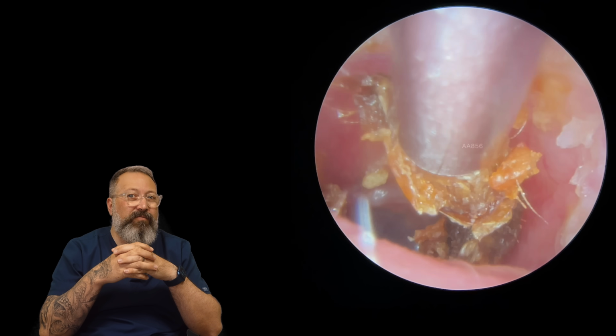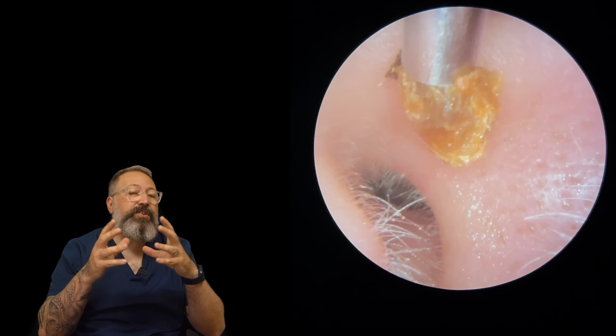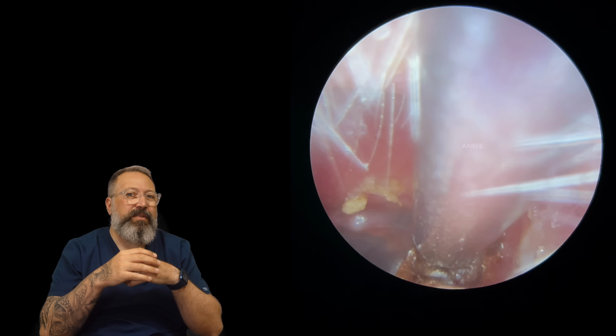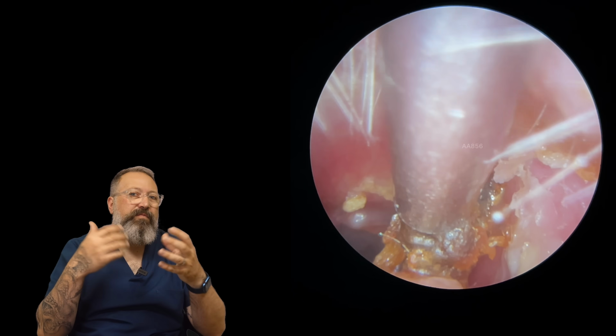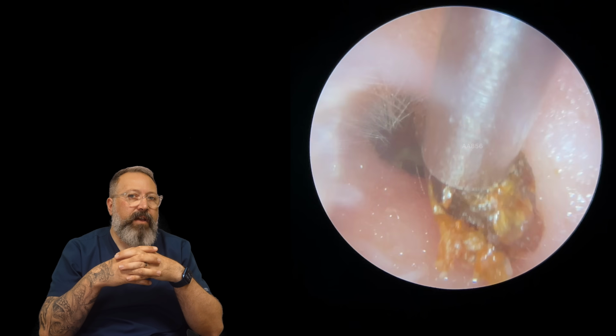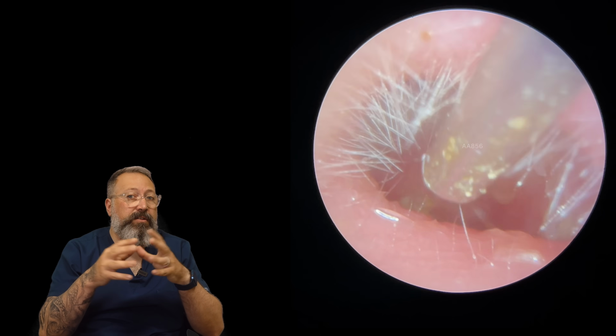Now you can imagine the relief the patient was feeling to get this out. The ear canals do look a little bit red. Obviously you've had a lot of dry skin sitting on top of those canals and it hasn't been able to expel the fresher skin from underneath. So everything's a little bit irritated in there at the moment. So let's get everything out. Patient's hearing better already because we can see the eardrum or part of the eardrum.